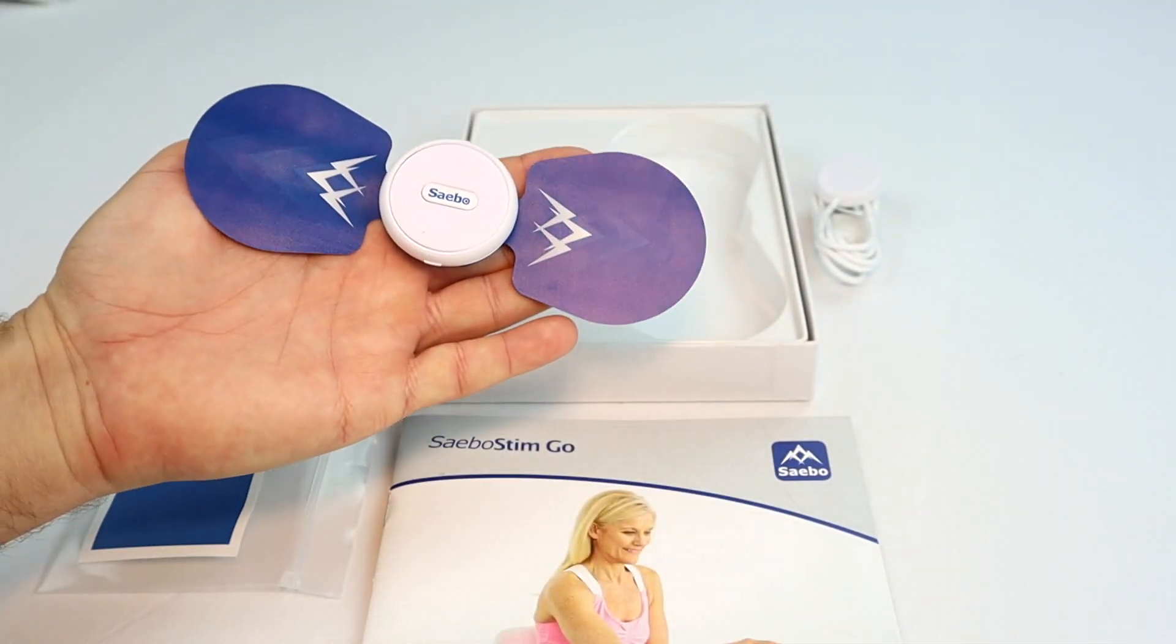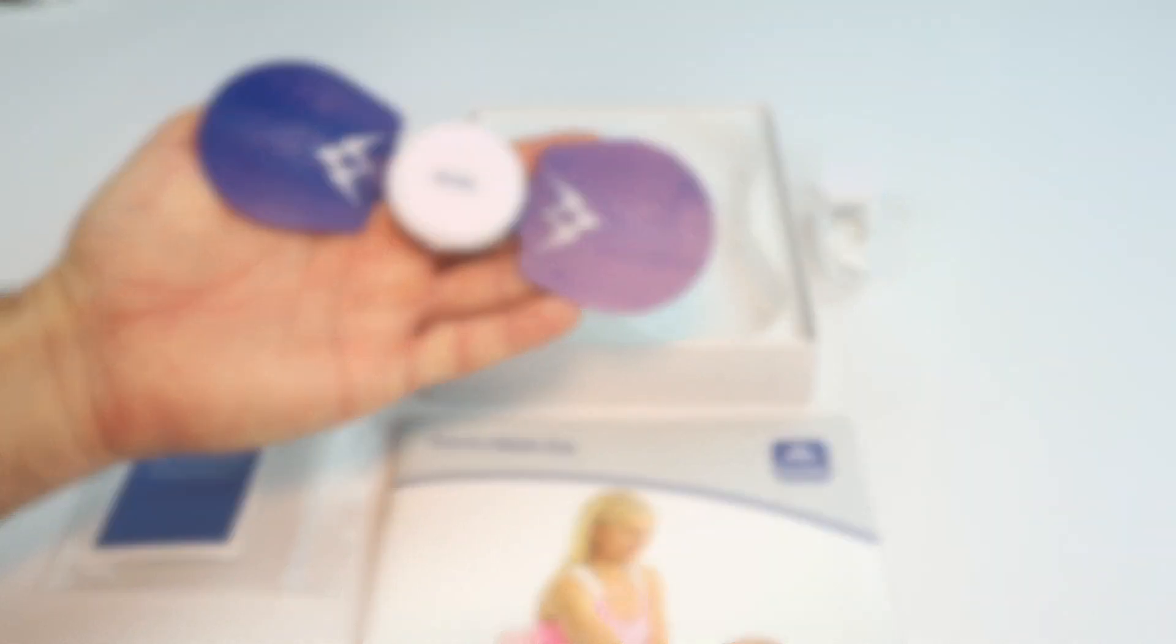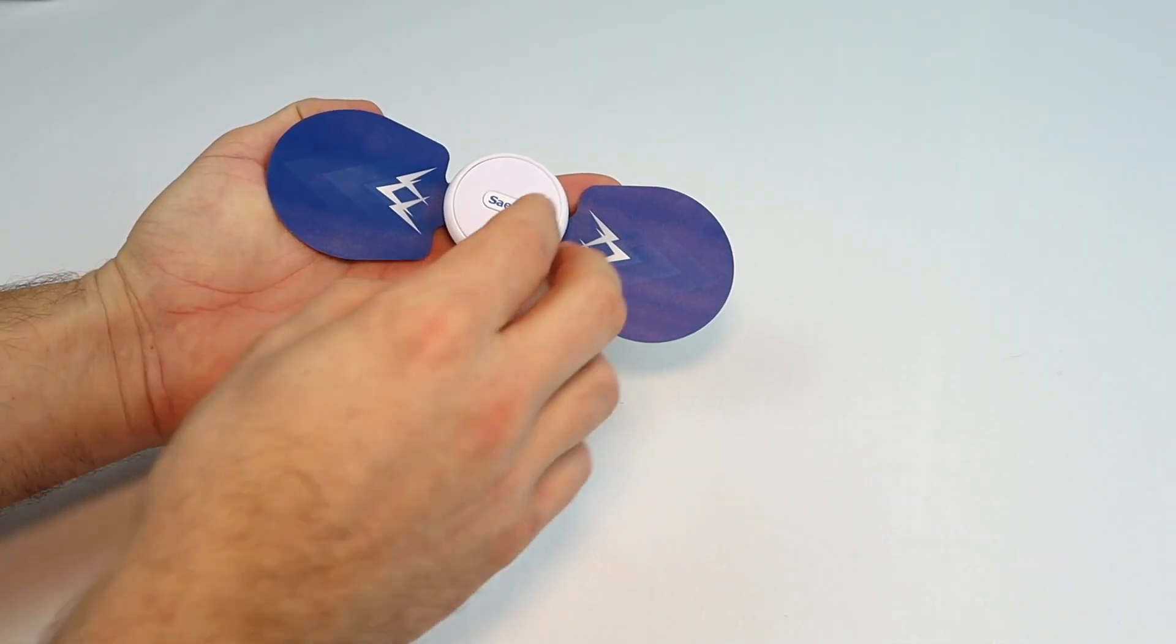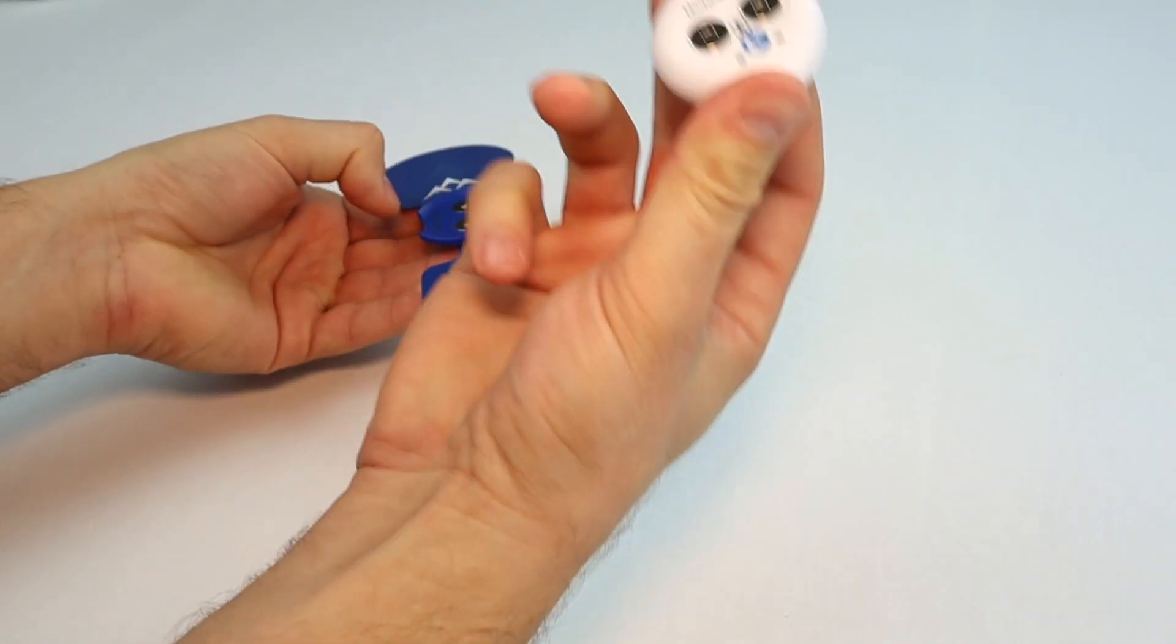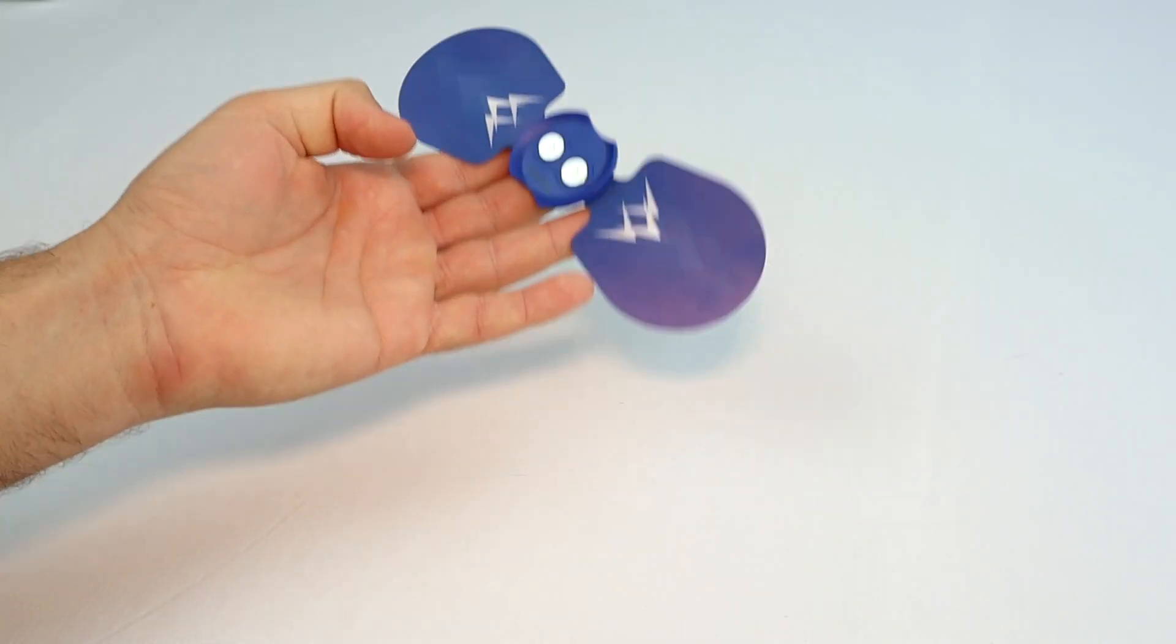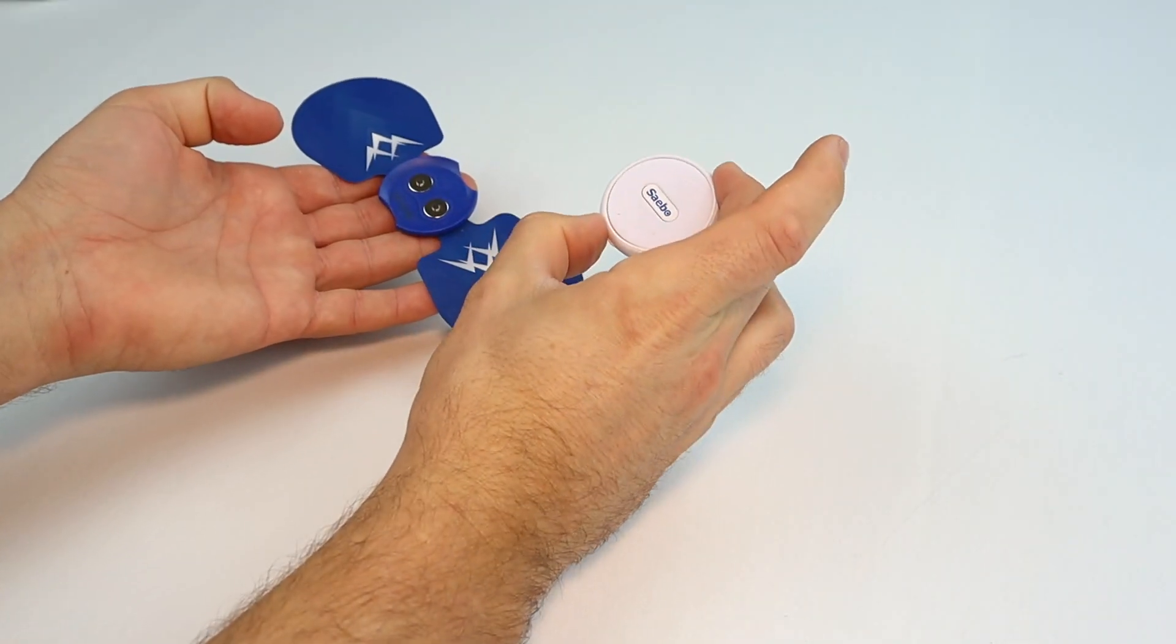And last but not least, this is the SaeboStim Go. The SaeboStim Go is made of two parts: the controller unit and the wings. The wings are replaceable, the controller unit is chargeable.